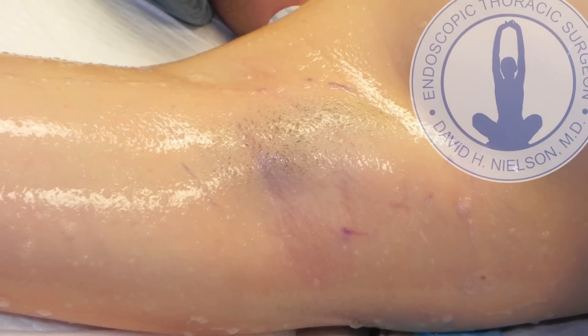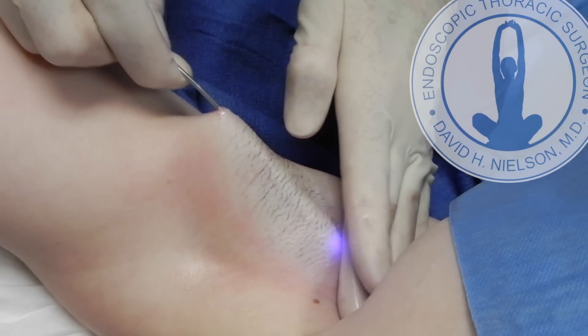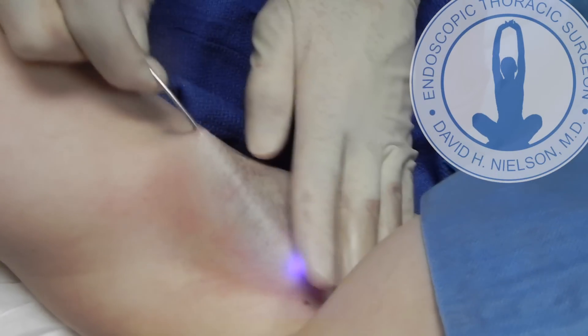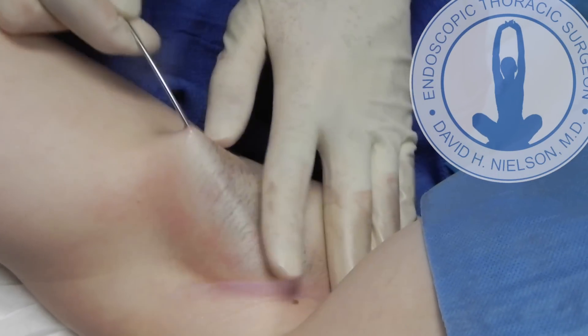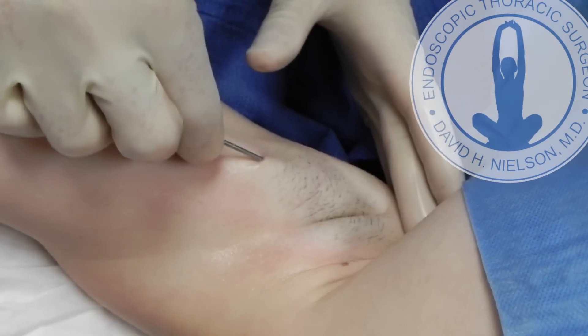This is Dr. David Nielsen in San Antonio, Texas. I'd like to show you my special SDLA procedure that treats severe axillary sweating. I'm starting with the right side. This is after the skin has been prepped, and I'll show you how through one tiny 1.5 millimeter incision under tumescent anesthesia — in other words, it doesn't hurt at all — I am lasering precisely the sweat glands found in the skin of the right underarm.